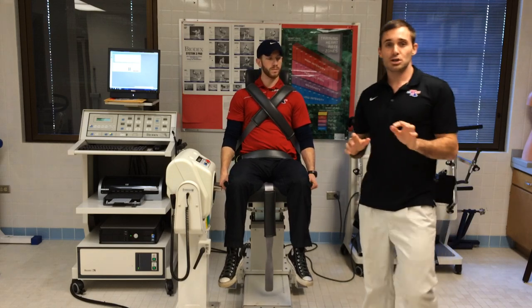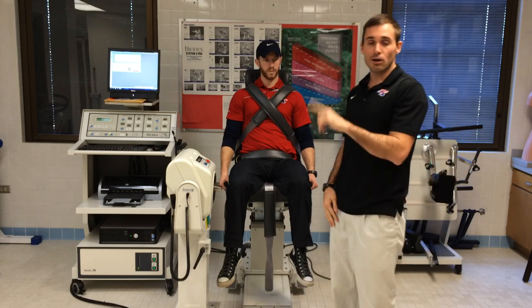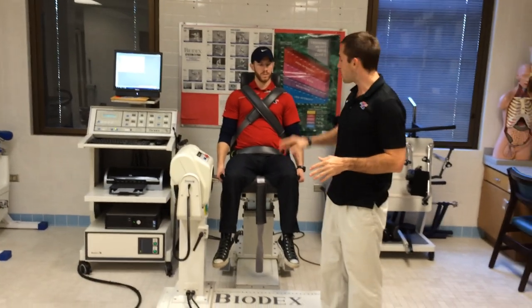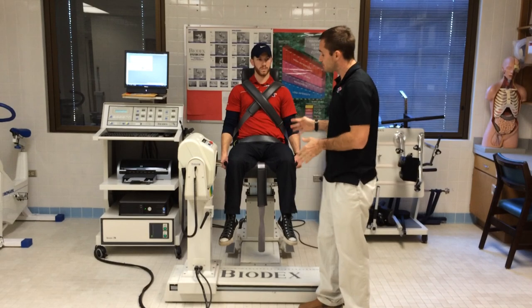The reason we use the straps is because when he's doing the kicking test, all the way out, all the way in, we want to make sure that his leg is the only thing generating momentum. We do not want the rest of his body to be able to generate momentum, so we're making sure he's all strapped in.